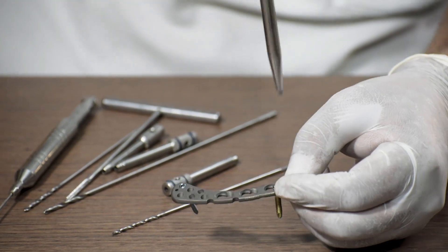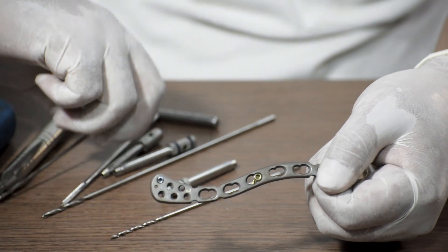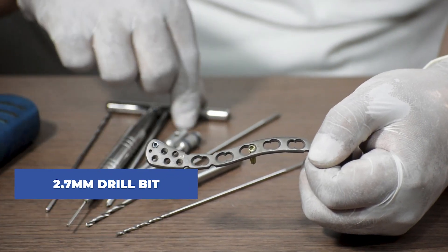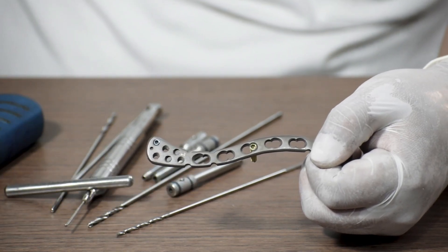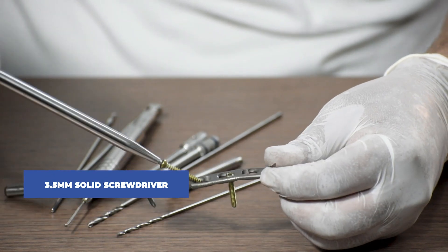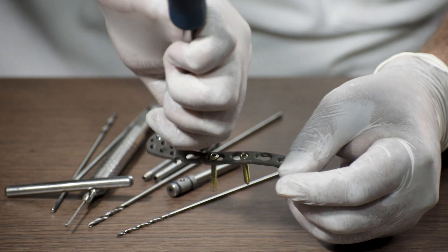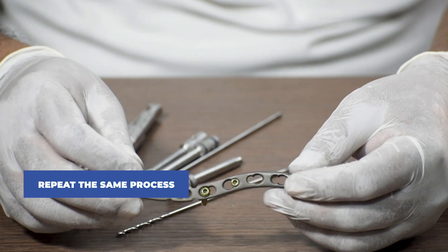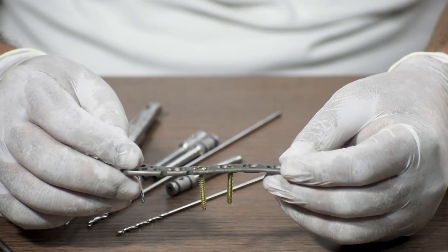Once again, locking screws get locked in both the plate and the bone. To fix a non-locking screw, we use a 2.7 mm drill bit to drill a hole, then a 3.5 mm bone tap if required to clear the entry of the screw. Then we take a 3.5 mm cortical screw, measure the length required, connect it with a 3.5 mm solid screwdriver, and fix it in the desired hole. Always remember, the surgeon makes the call on which kind of screw is needed and in which hole.